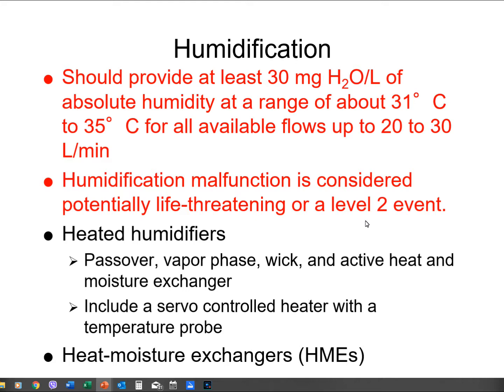Now this takes me into just a little bit of a rant in terms of your HMEs. Guys, please be very, very observant of your HMEs when you do rounds. Make sure you do rounds. If someone has thick tenacious secretions, you do your rounds every hour and a half to 2 hours. You make sure those HMEs are not clogged.